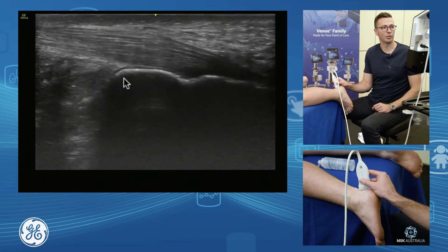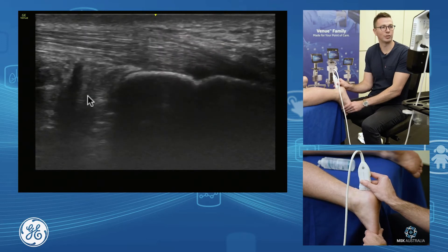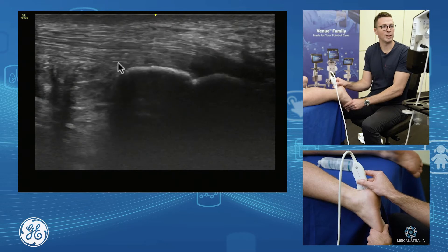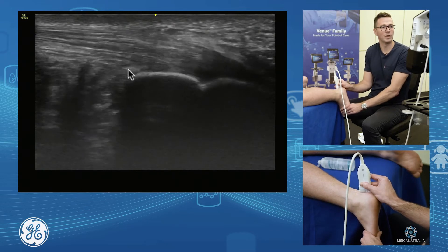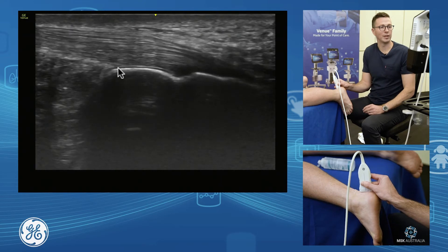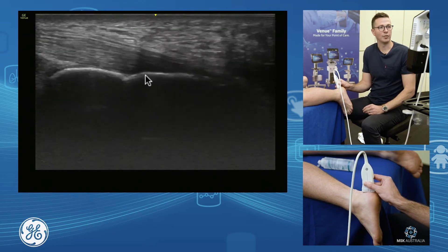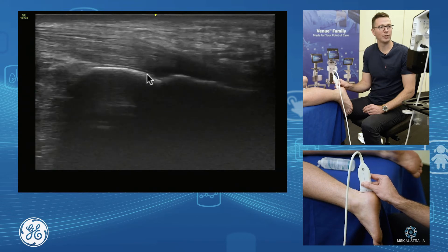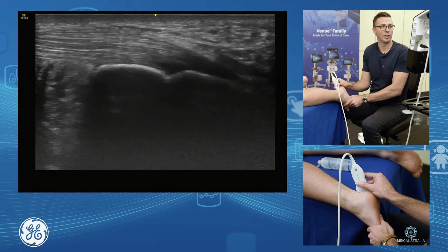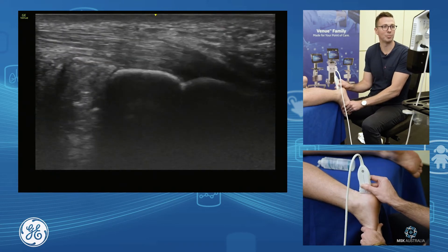If we go longitudinal in through here and do a little bit of plantar flexion and dorsiflexion, we can see a bit of fat pad sticking its nose into the retrocalcaneal bursa. We can appreciate that this space on the superior posterior aspect of the calcaneus is not where the tendon inserts — it inserts down on the enthesis down in through here. This is just an area where the tendon lays over bone, with the retrocalcaneal bursa and fat pad that can sit in there and act as a bit of a space-filler.